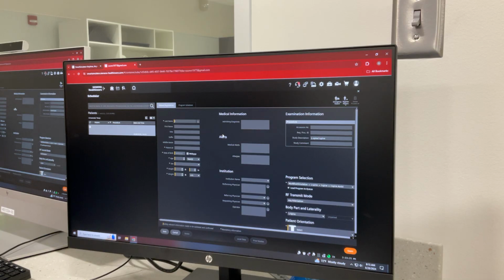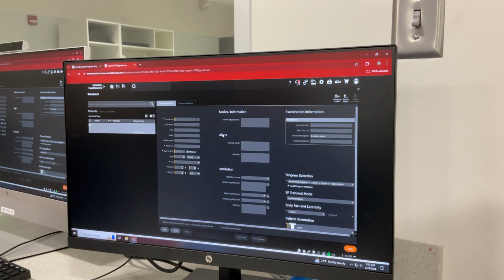And then this is where we would put in our patient's information, their height and weight, all the information that was on their screening form. So go ahead and enter that, but after you hit the weight, I want you guys to stop and hold up, okay? Pick any name and pick anything you want. Now on practical day, you would be going off of your sheet and entering the appropriate stuff, but for practice purposes, you can enter anything.